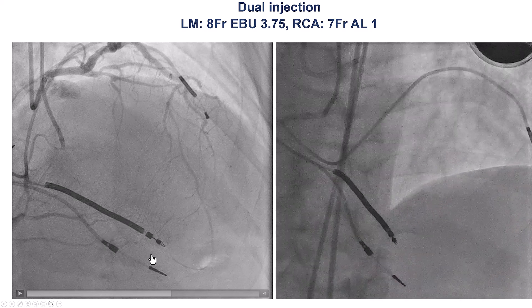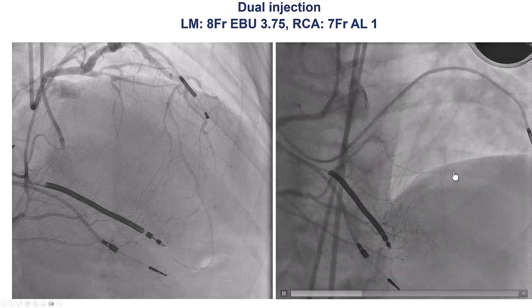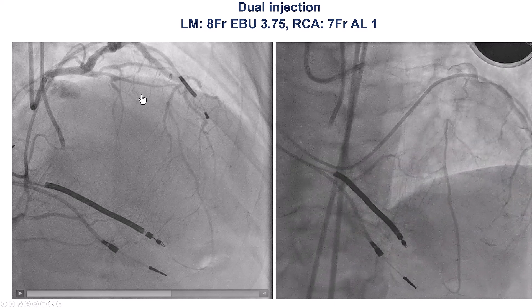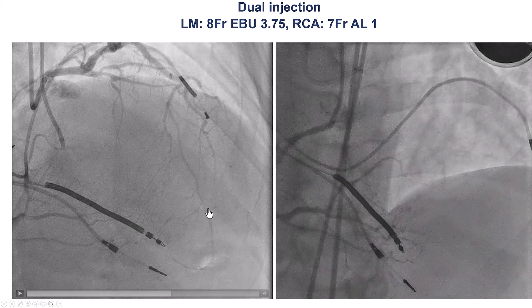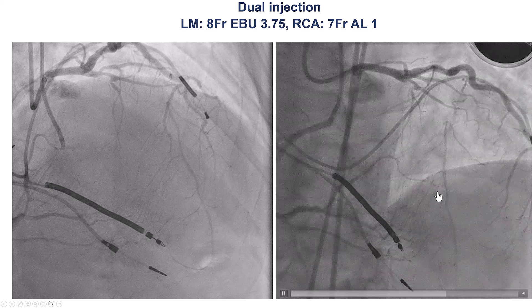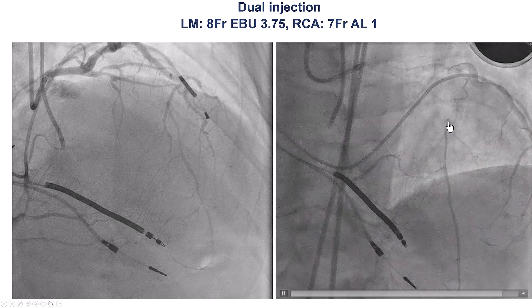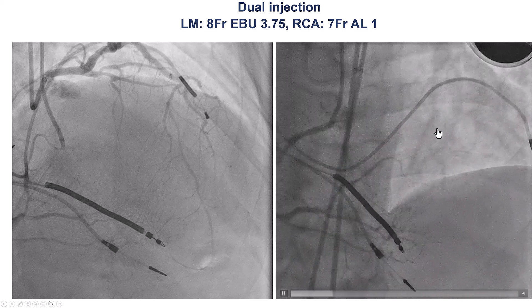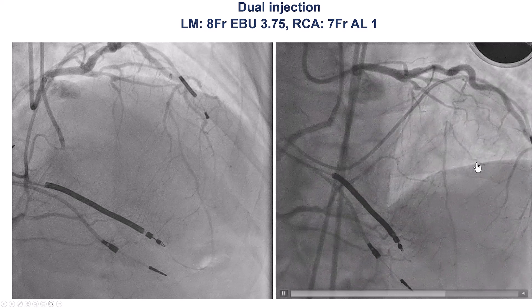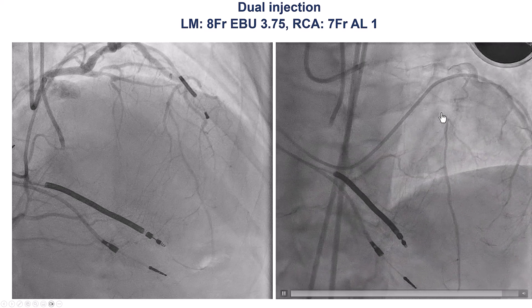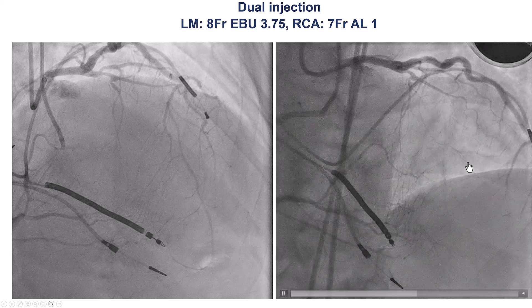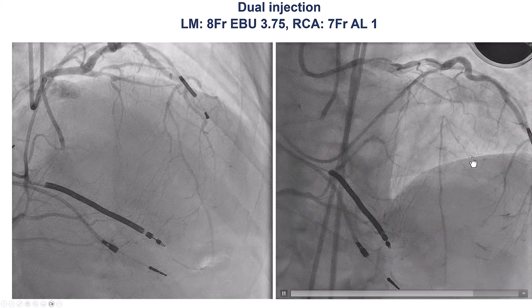We do have septal collaterals coming from the PDA all the way to the LAD. The lesion length is about 25–30 mm, and the distal vessel is small and diffusely diseased, likely because of underperfusion due to the long duration of the occlusion. We also see that there is a bifurcation on the distal cap — another diagonal coming off there — which is fairly common, as flow is preserved to side branches.